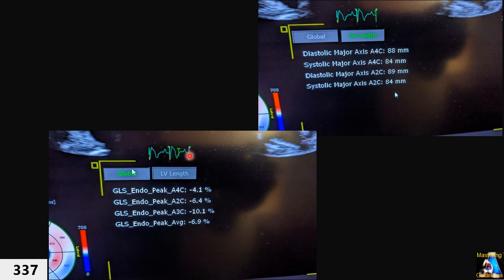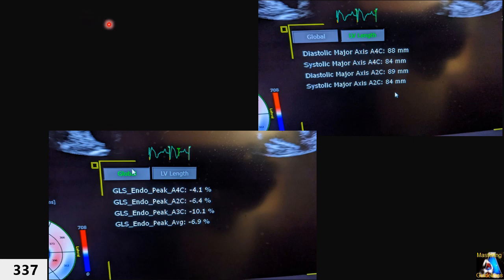The second result is the global longitudinal strain. The label 'endo' means the machine traced based on the endocardium. Different layers of the myocardium — endo, mid, and epi — each have different strain values. Some machines and software vendors show all three layers separately, giving numbers for each across apical four, apical two, and apical three, then provide an overall global longitudinal strain average. In this example the global longitudinal strain is minus 6.9 percent. Always correlate these results with what you observed visually in the 2D images for each segment.